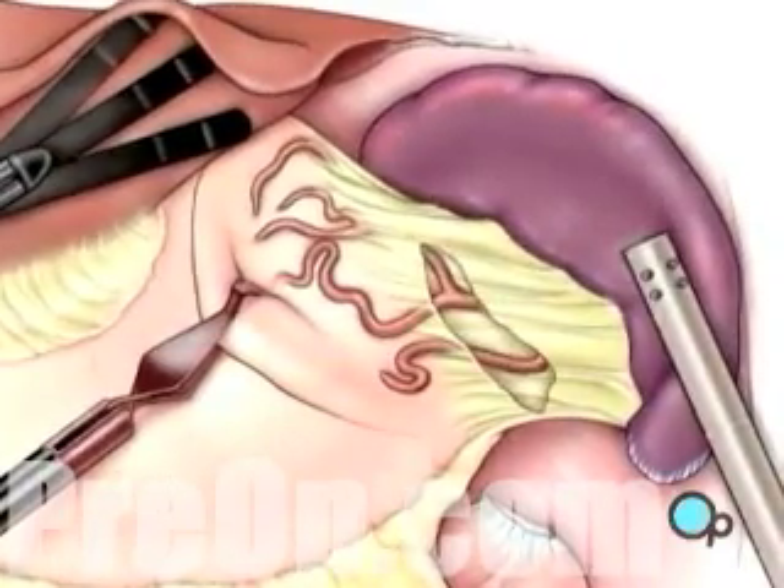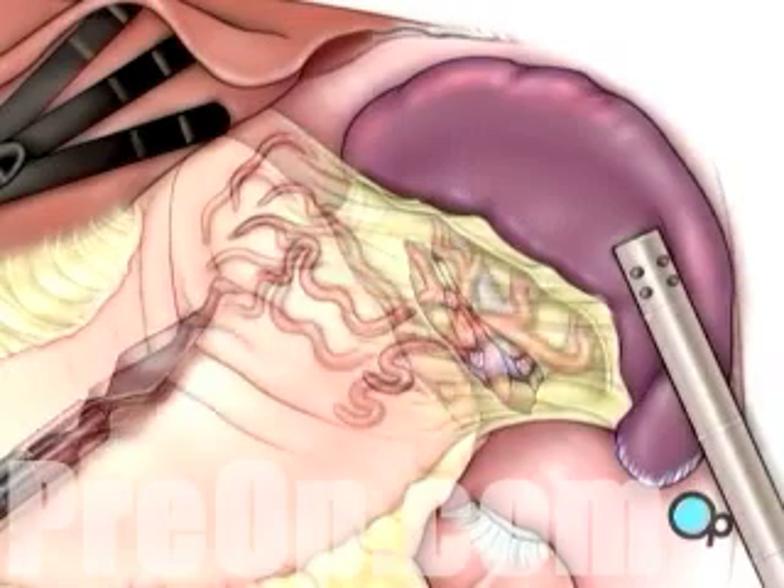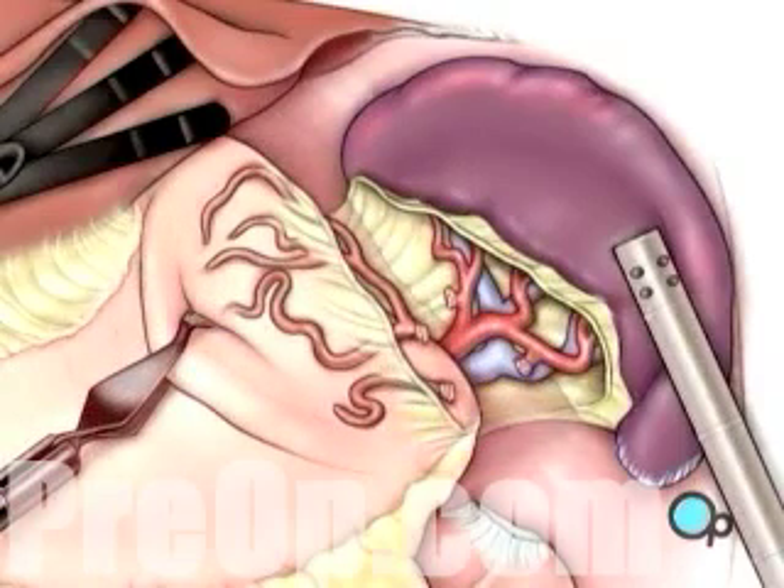All remaining tissue between the spleen and the stomach, including small blood vessels, as well as the spleen and diaphragm, are cut.